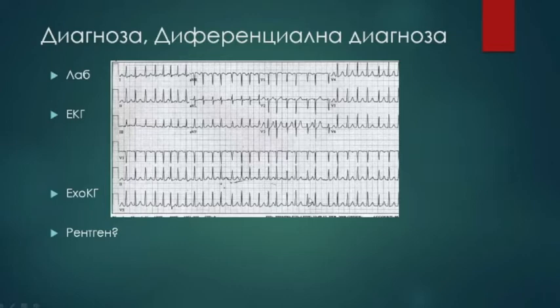No, they aren't. Yes, so you have tachycardia, right? So you don't see a P wave, especially here when the RR intervals are a little bit longer. You don't have P waves here. So you have a rhythm disturbance with different RR intervals and no visible P wave. So is it atrial fibrillation? We have atrial fibrillation, right? So you have a rhythm disturbance.